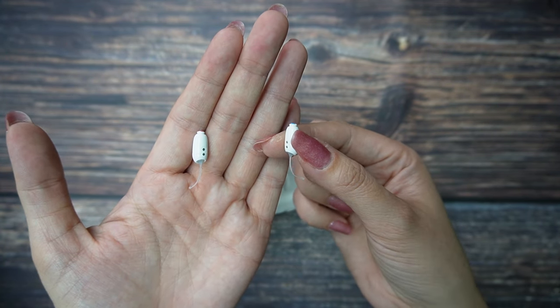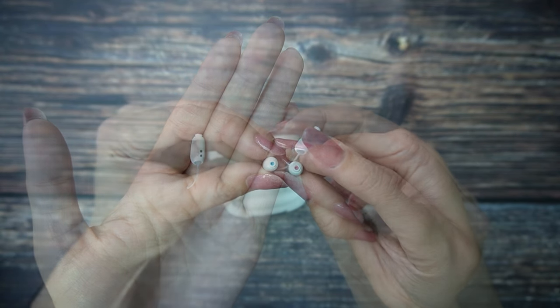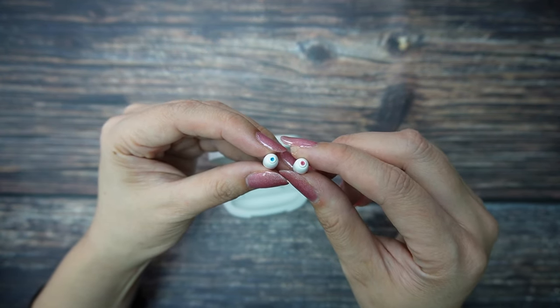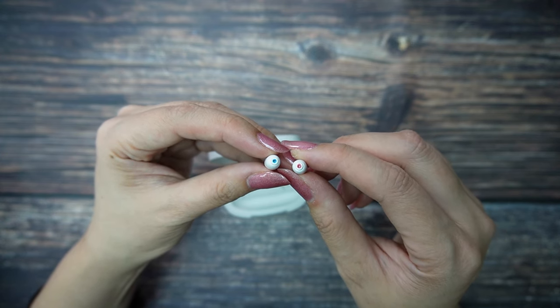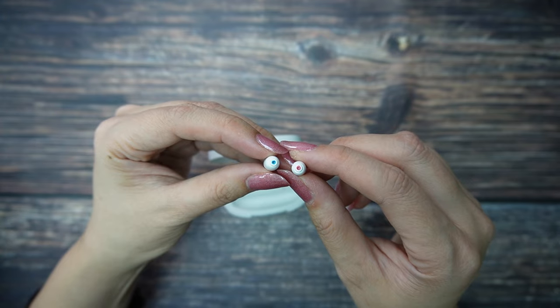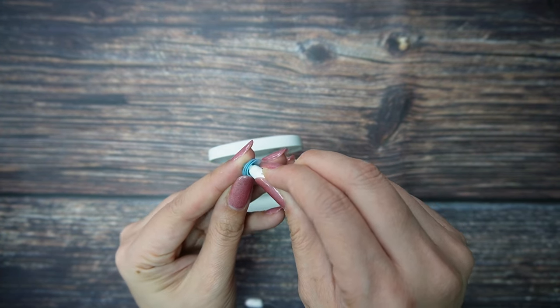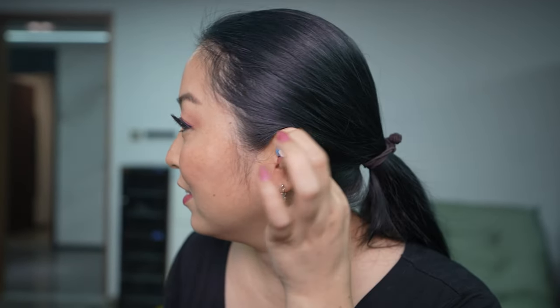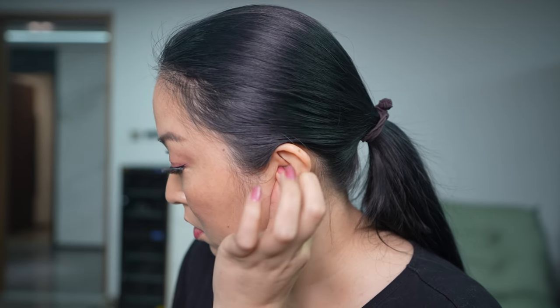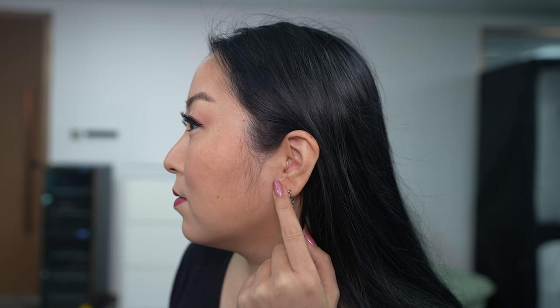The hearing aids are so small it's even difficult for me to hold with my fingers. If you look at the edge, one side has a red color indicating the right side and the other has blue indicating the left side. To install the ear tips, you just need to press until you hear one click and it's done. To wear them is very simple — just hold by the thread and gently put them in your ears. Make sure you fit it properly with the thread edge pointing down.